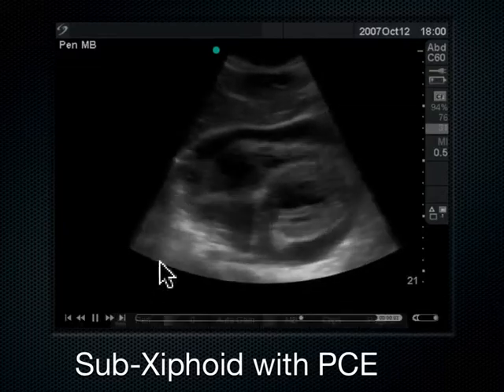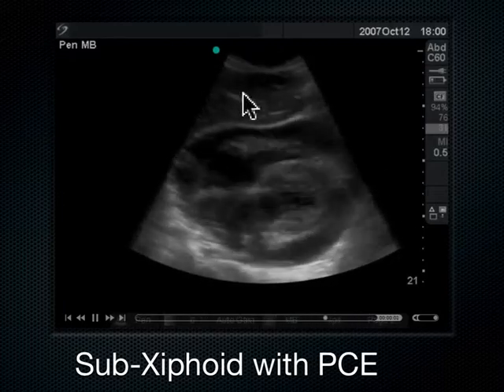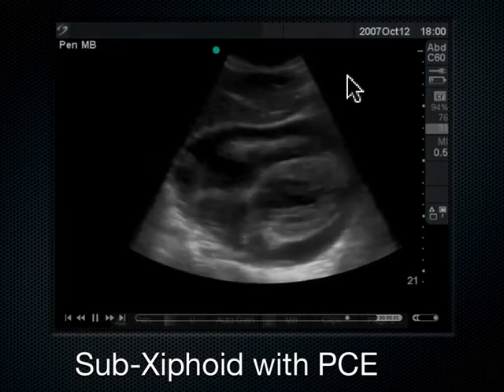We can make out all four chambers. We're using that liver. We see a lot of liver at first, and then we go into the subxiphoid notch where we see more of the apex. Without this liver, you cannot see the heart in a subxiphoid approach. So someone who's got a very small cirrhotic liver, you can't get these windows.